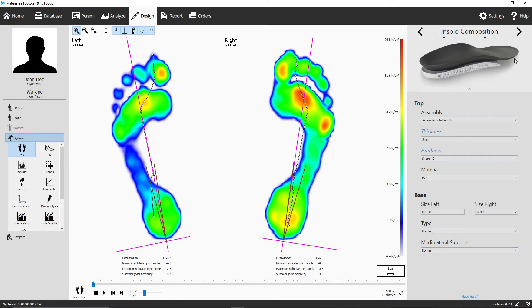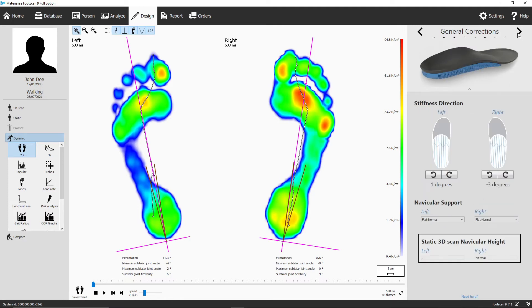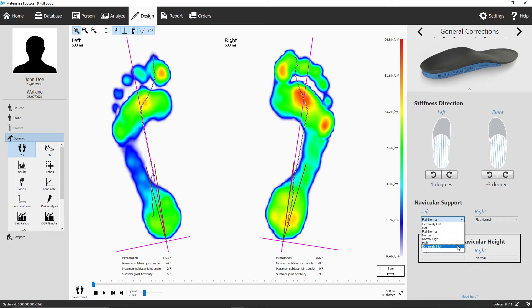On the next panel, you can choose the general corrections of the insoles. Both options are suggested, but especially for the navicular support, it is recommended to double check whether your patient can handle the amount of correction, as this option will influence the height of your medial arch support.